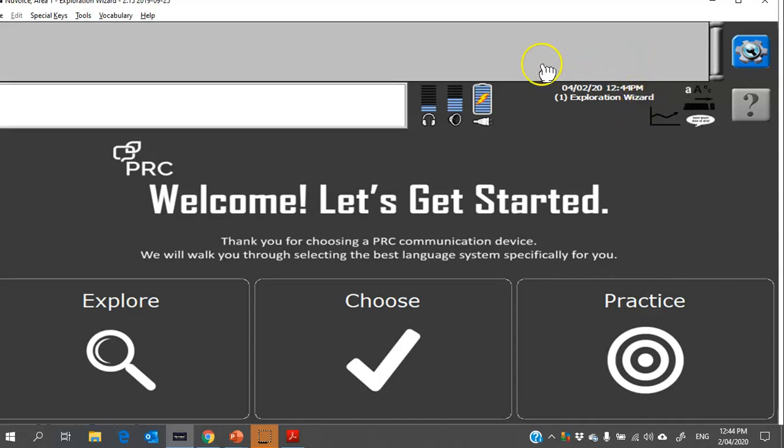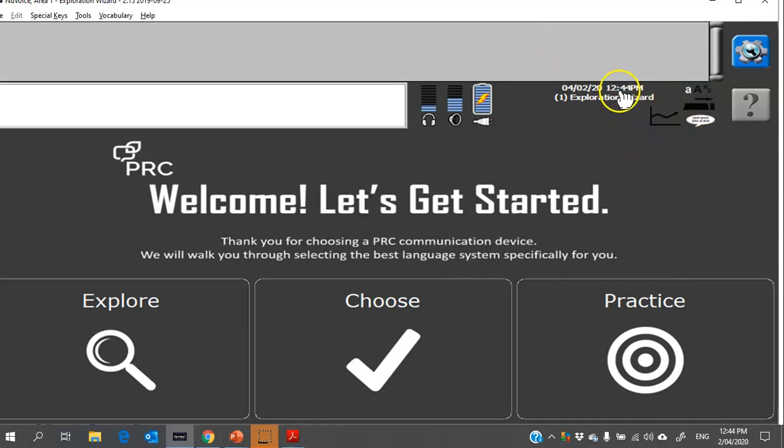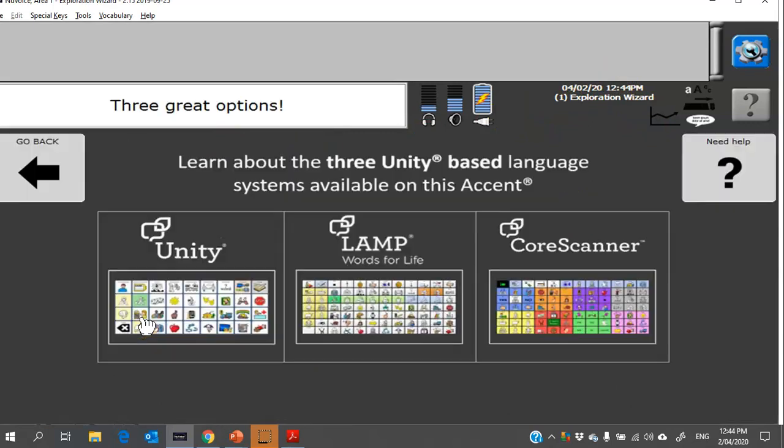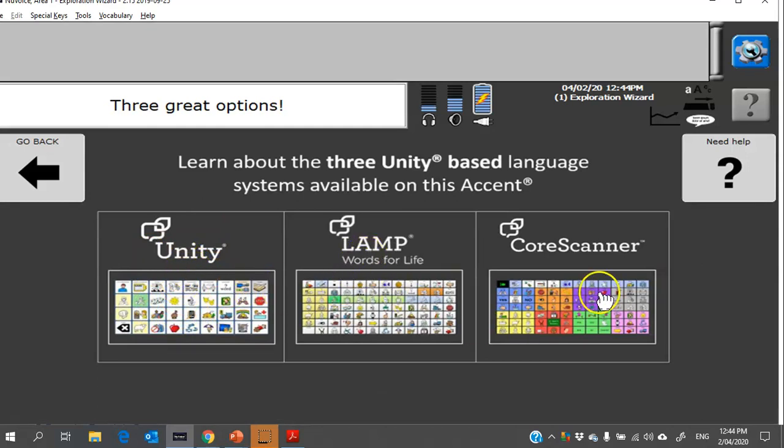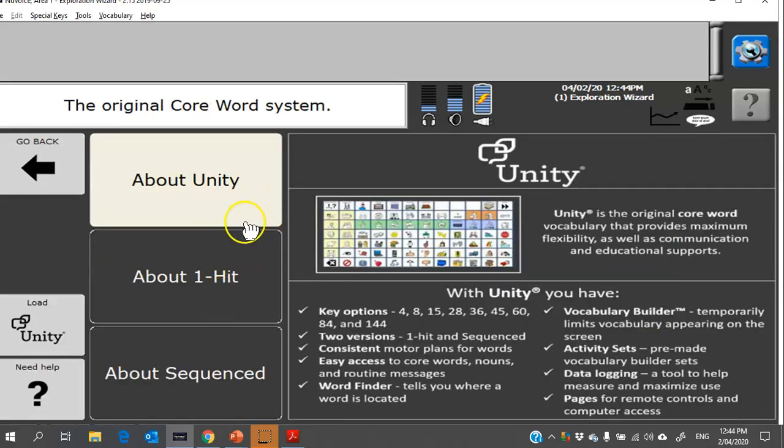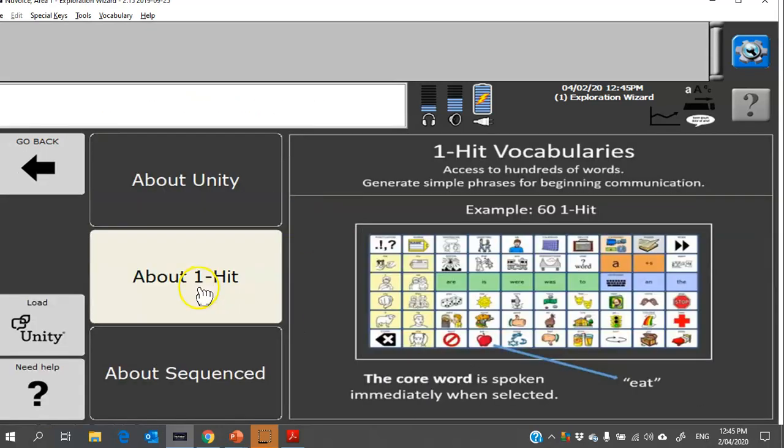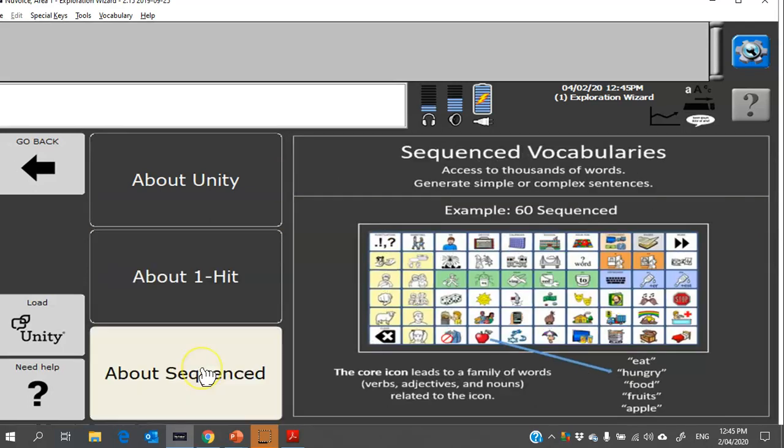All right, so when you turn the device on it should open this exploration wizard. Normally I take a look under Explore and you can then have a look at Unity, LAMP Words for Life, Core Scanner, the different systems that are available on the device. Once you click on one, you can go in and read more information and you can make a decision about which particular vocabulary you would like to choose.